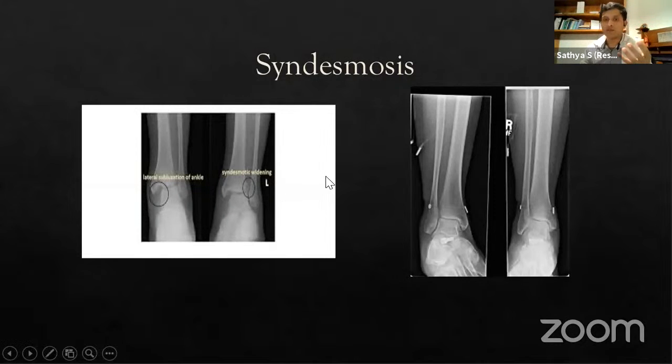So as a procedure, previously they used to pass a nail through, an intramedullary nail, or across, as I have shown you here. This technique is called internal bracing. This is the recent bracing technique that they use. But prior to this, they used to put screws.